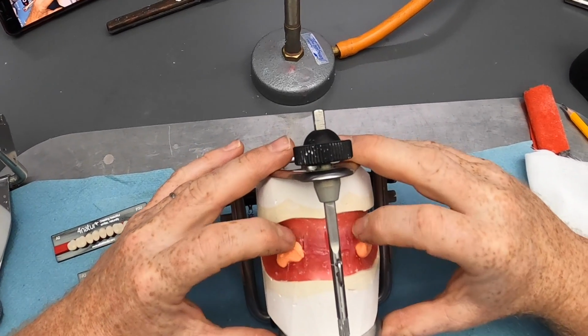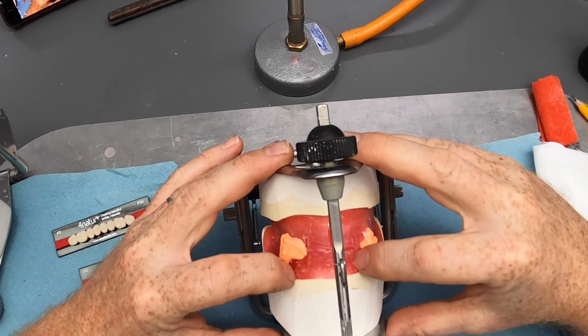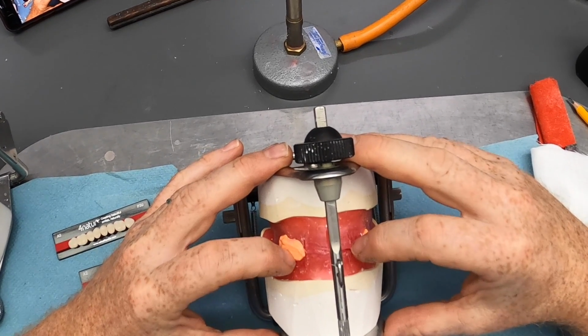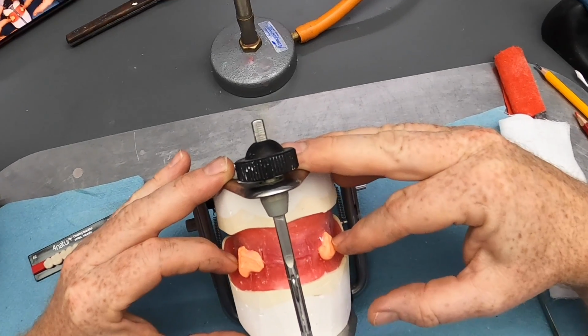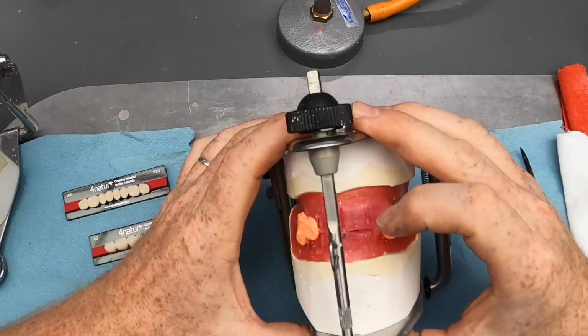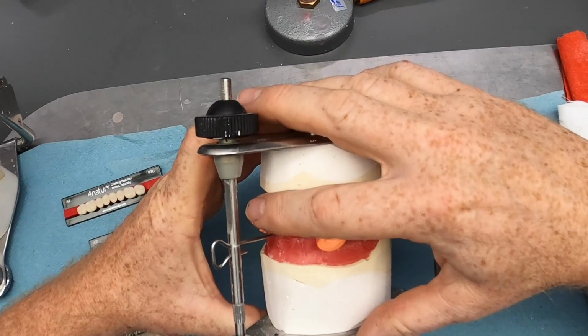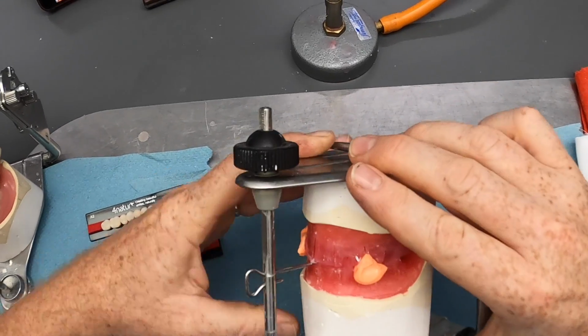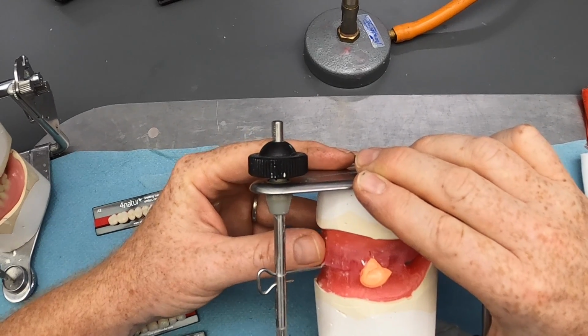The information that we've recorded clinically, hopefully you've watched the clinical video, is now used to position the teeth. So we can see where the occlusal plane is going to be. So these are the essential 5 bits of information that need to be recorded. So you can see the occlusal plane, the lip support, as shown by the labial surface of the upper block. That's where we're going to put the labial surface of the upper anterior teeth.